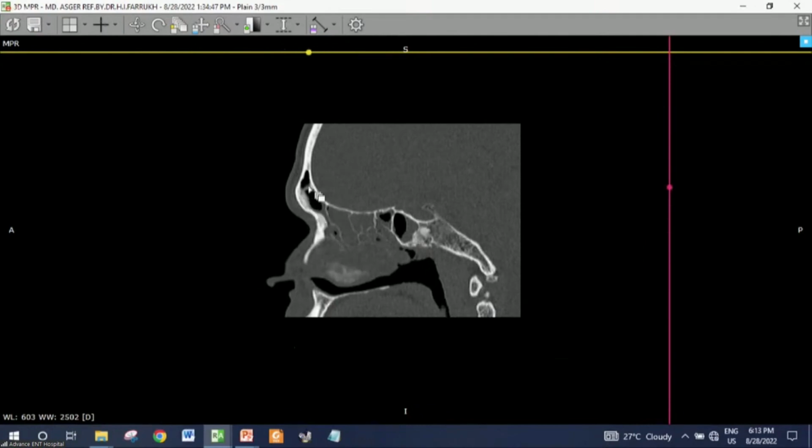This is the beak anteriorly, this is the frontal outflow, and this has narrowed the frontal outflow from behind. Now, this cell we can't afford to go behind and fracture it out. This is the cell attached behind, attached to the skull base, going up.